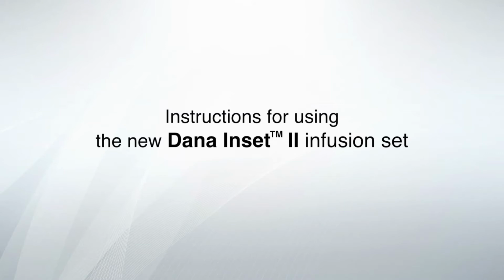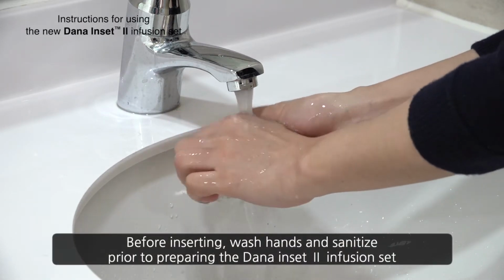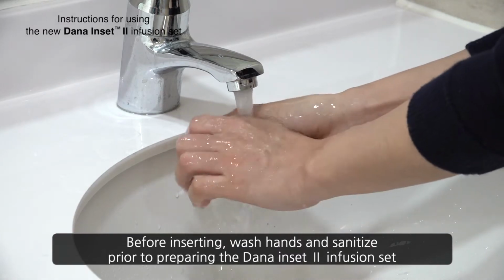Instructions for using the new Dana Inset II infusion set. Before inserting, wash hands and sanitize, prior to preparing the Dana Inset II infusion set.